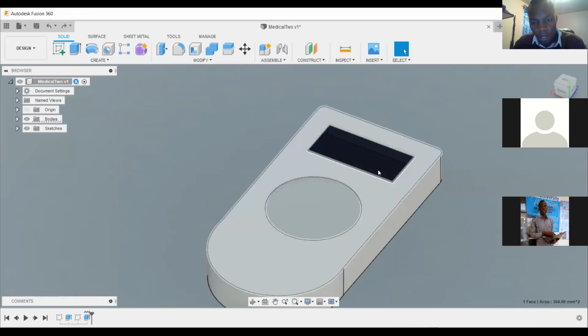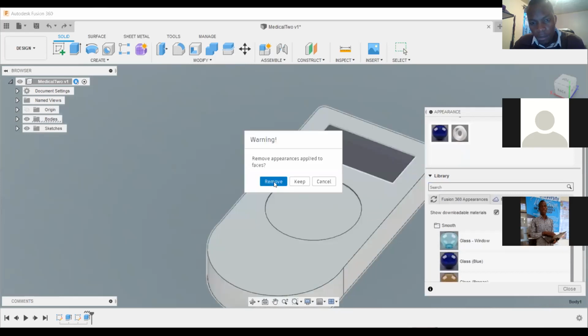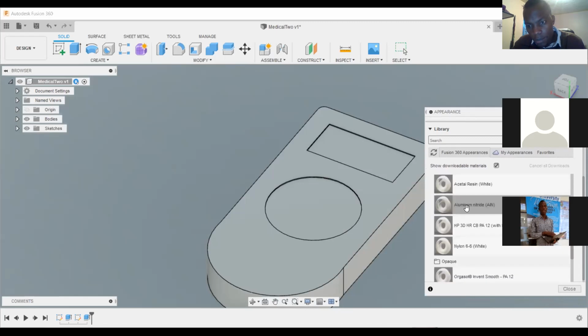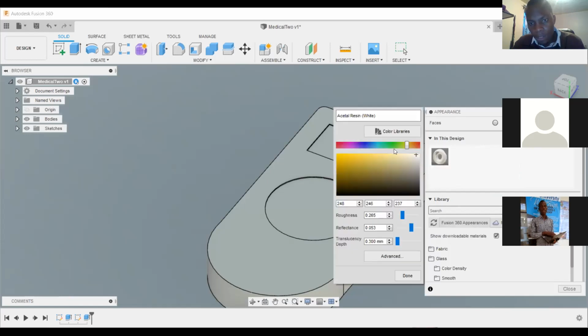You can change the appearance. You want the whole thing to be made out of plastic. So ABS. And then you can remove this. Then you double click on that. Then you want to change the color to be like blue, some navy blue, some light blue.